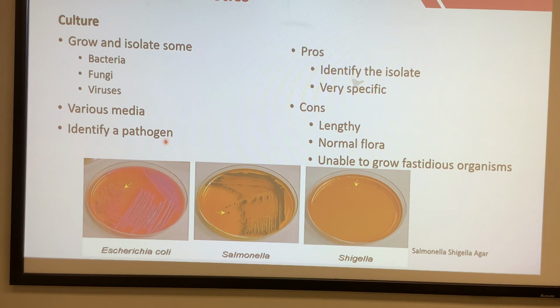Sometimes the fastidious ones take more than 2-3 days to grow, and that's why the physician constantly calls the lab, where is my identification? Oh, I don't have it because it's anaerobic. It takes a week to grow, or it's a fungus, which takes really long to grow. And a lot of times you're gonna collect your normal flora, and they are gonna grow like crazy on your agar plate, and that's gonna interfere with your identification as well, right? You have to be very familiar and knowledgeable when you're handling the identification of different colonies. And of course, it won't be able to grow fastidious organisms, not to mention anaerobes and such.